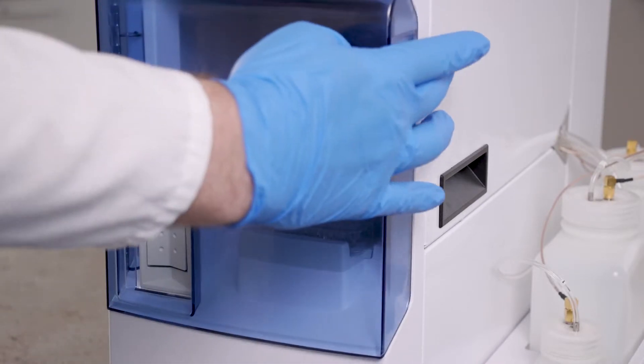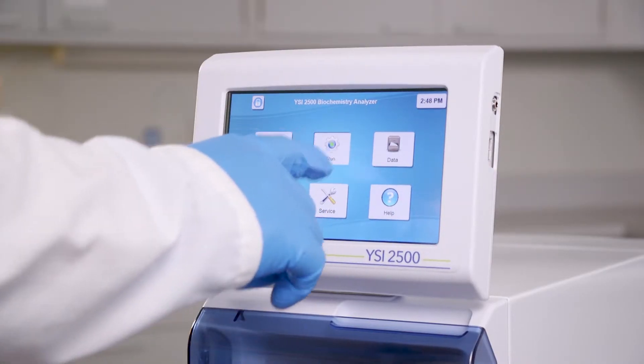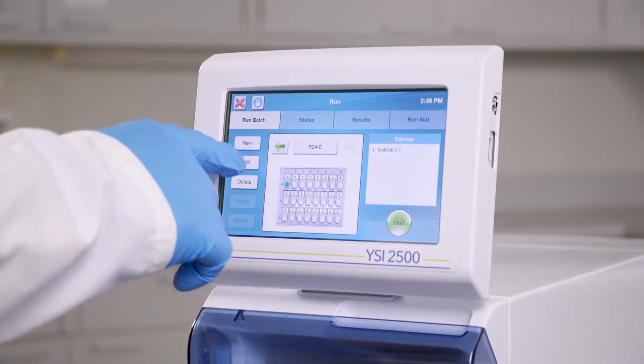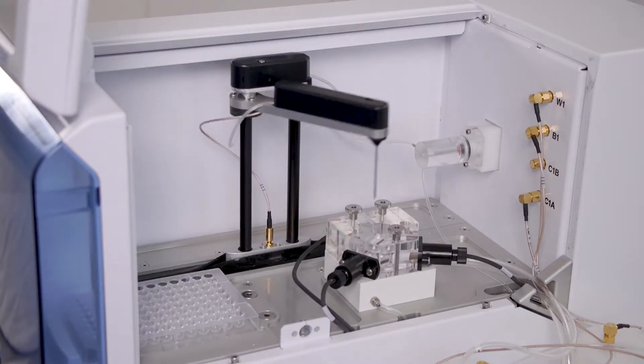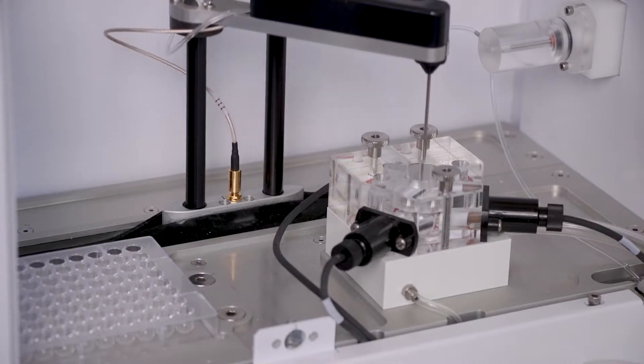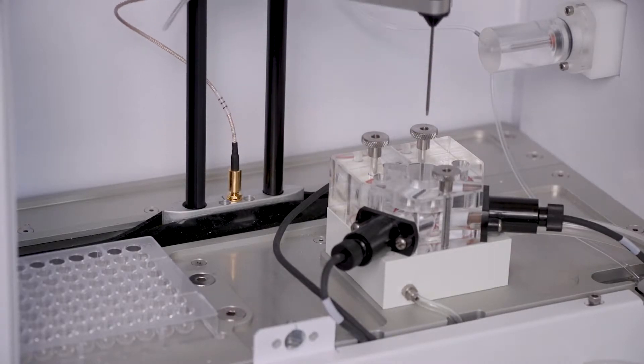And like the YSI-2900 Biochemistry Analyzer, the YSI-2500 Glucose Lactate Analyzer offers full sample automation for up to 96 samples. Small sample sizes ranging from 10 to 50 microliters.